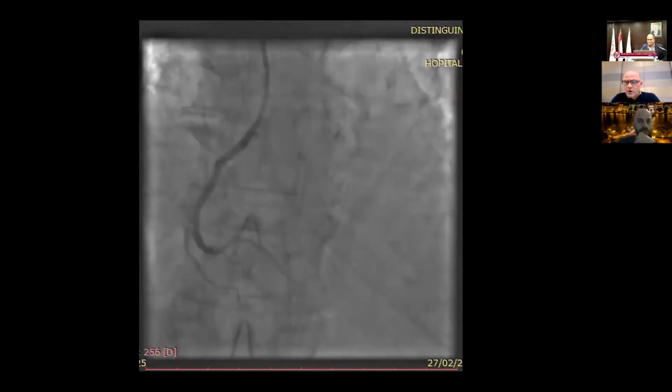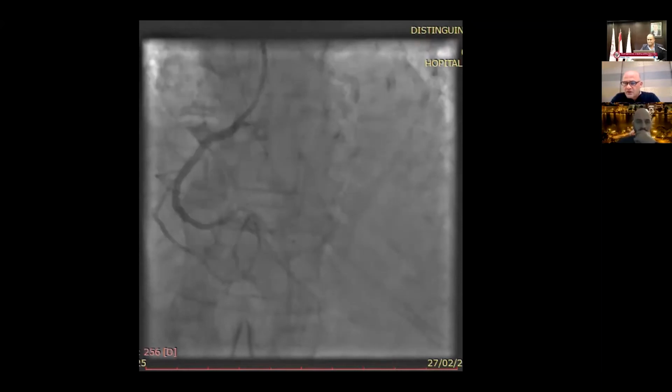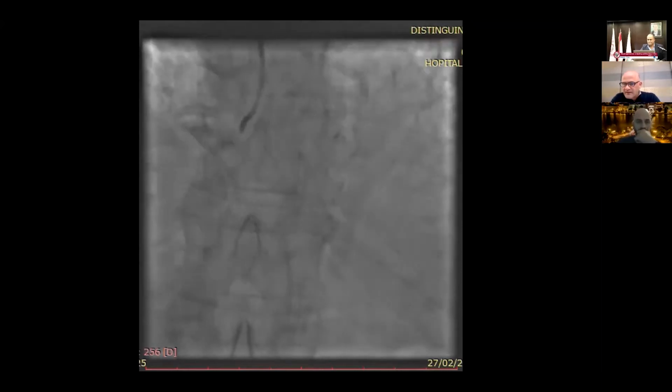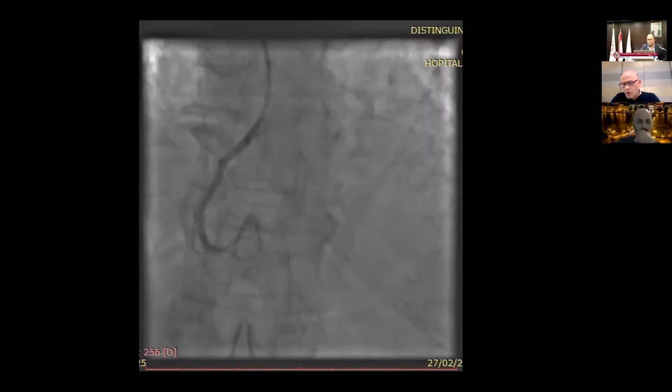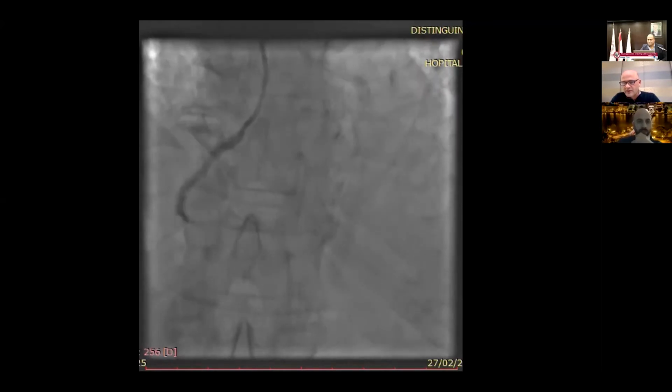And concerning the issue of treating these lesions, it would be in a stable phase, when the patient goes from the unstable into the stable condition. Is this scenario okay for all centers who have no rotablator on the table?